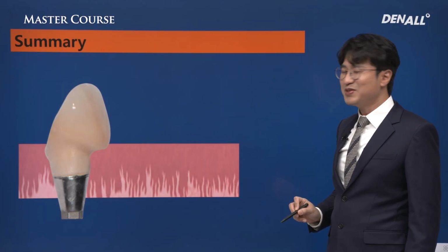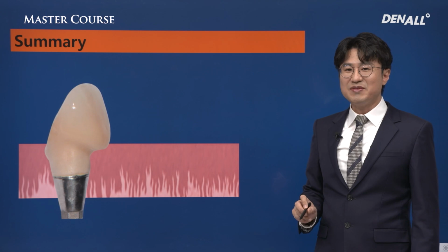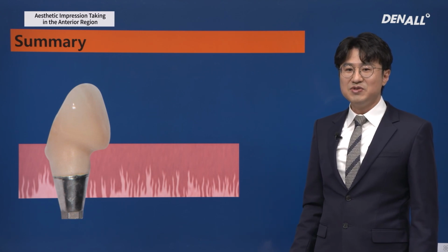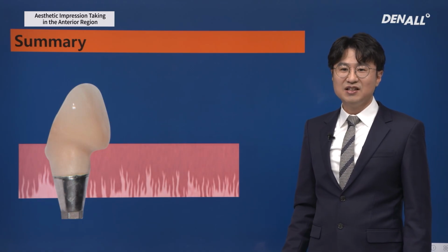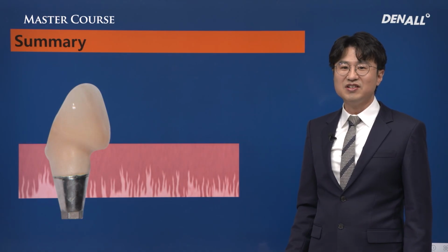A lab sent us this. This is the final prosthesis they sent us. Let me talk about the meaning of provisional tooth that is used to mold soft tissue, and individualized impression coping is used for impression taking. That is the ideal approach.